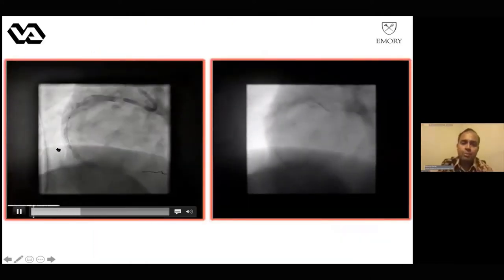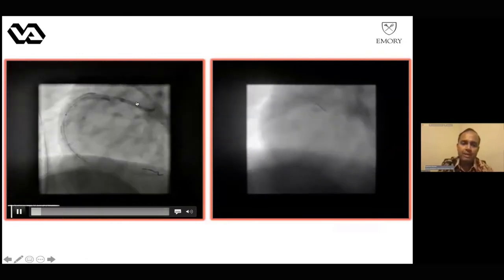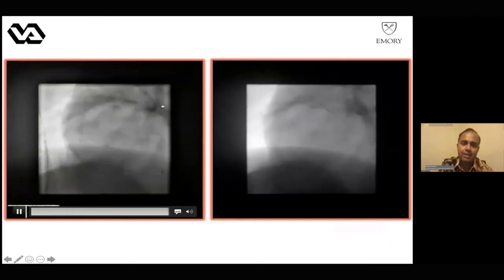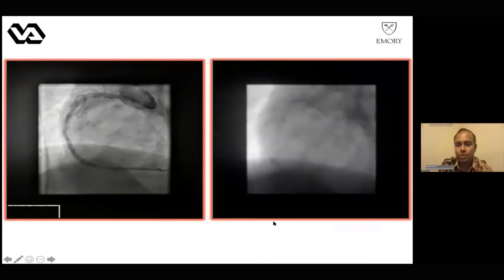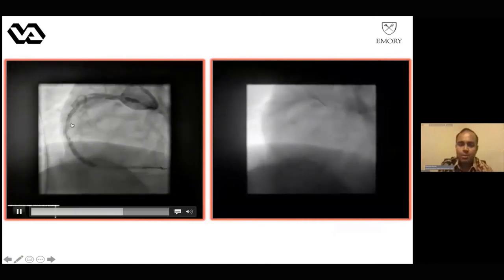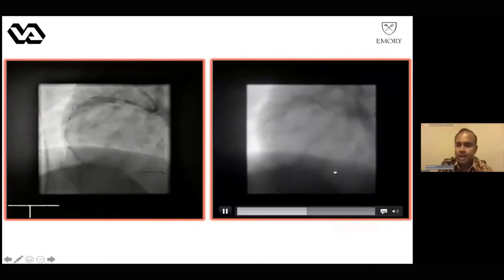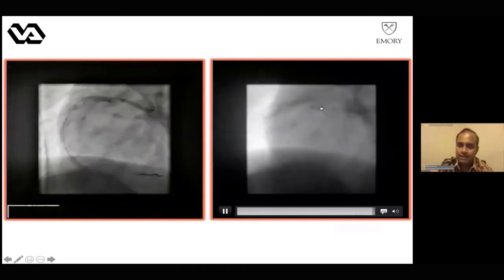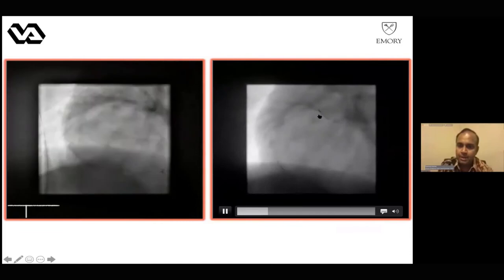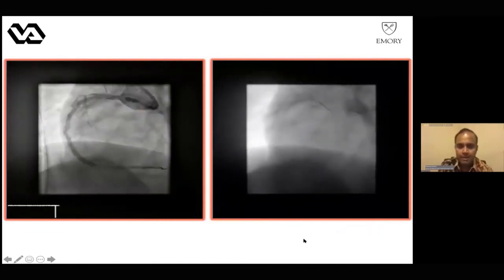And so at this point, my partner and I didn't really take too many pictures. We disengaged, we kept our guide disengaged, just took a little puff to ensure there was flow, went back in with a new coronary shockwave balloon, and we retreated the area of underexpansion of the stent because that was our goal there that day. After doing that, you could see that there is now dye staining in the sinus of Valsalva with a little bit of contrast extending there.